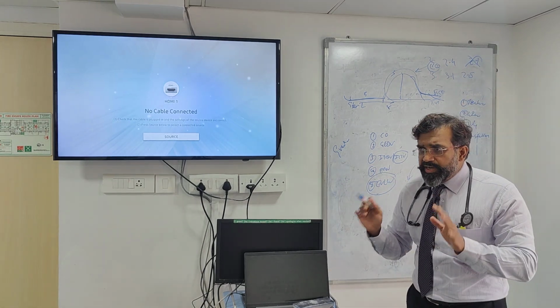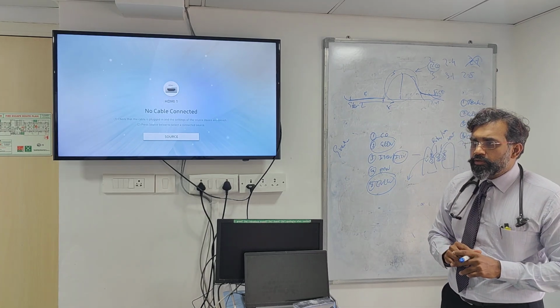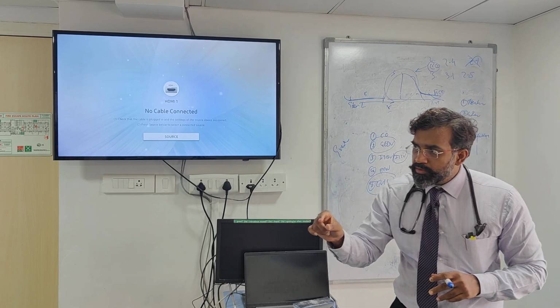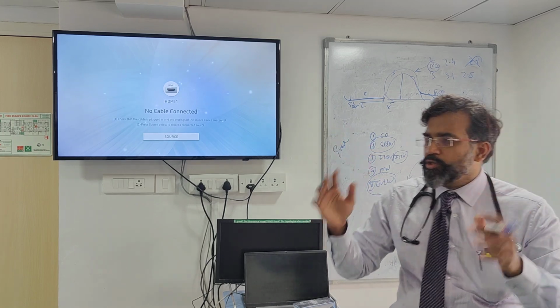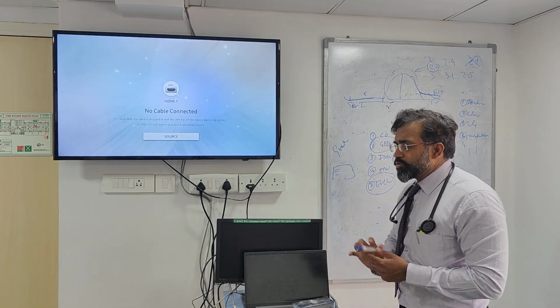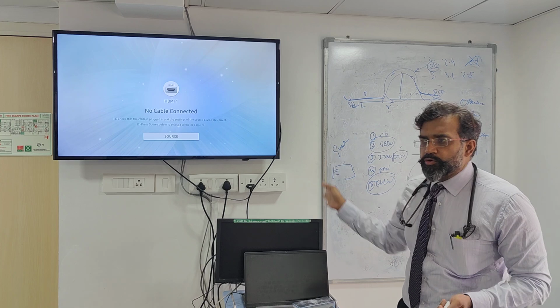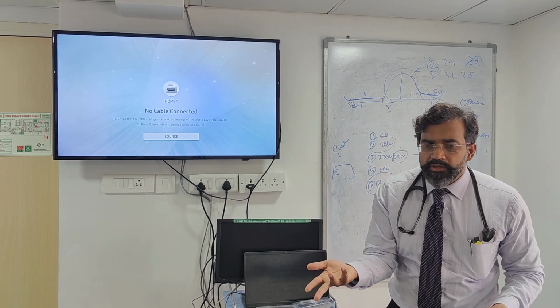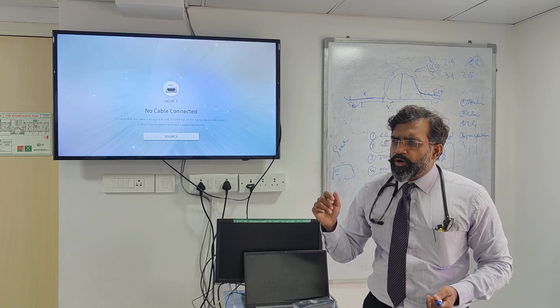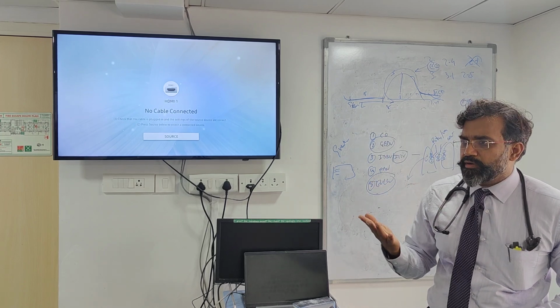So now GEDV, global end-diastolic volume. How does this come? I was telling you about the other button that you press, where you get all the details. Once you get a first key, in this main screen you can get whatever values you want. You just have to change it. Whatever values you want, press on them and take them out. So your main screen will get those values. If you don't want those values, take out this and put in new values. So you can put 8 values over here. But if you want calculated values, like for example SVR or indexes, they are calculated.